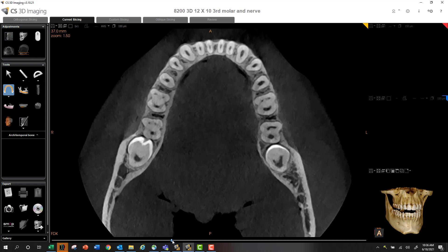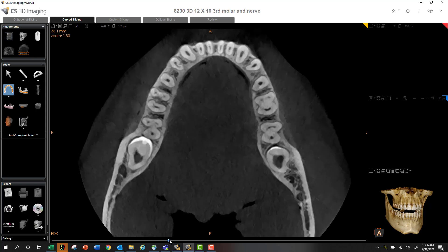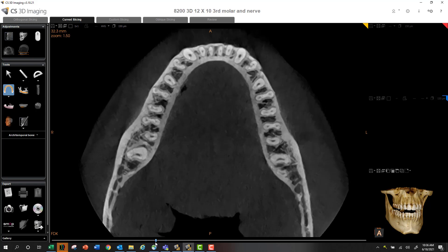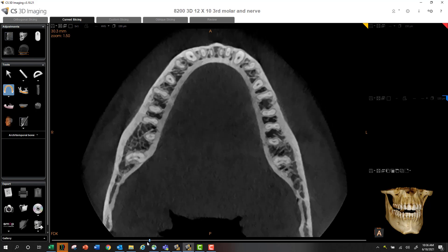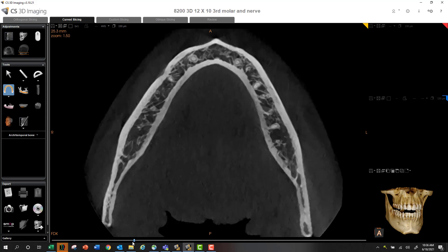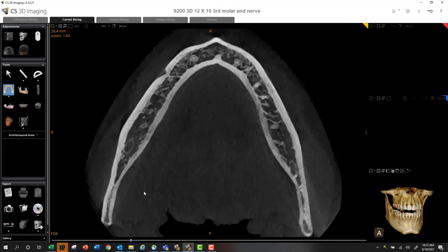So let's grab our axial slice and we're going to scroll until we see our mental foramen. All right, we can begin to see it right here.